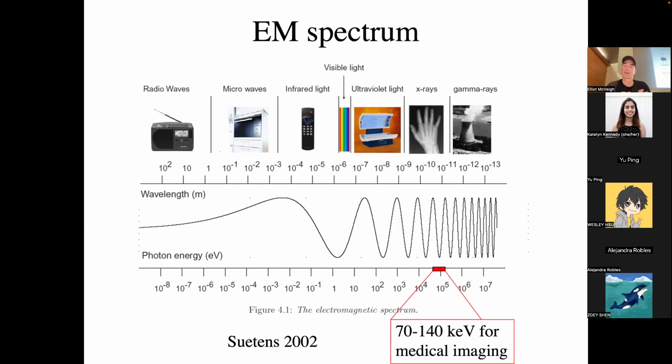I realize we've got a lot of frequencies running around here. The fundamental thing in imaging is the spatial frequency, the cycles per millimeter of the pattern of the thing I'm imaging. The frequency in megahertz here is the frequency of the radio frequency energy coming through. That has nothing to do with the spatial frequency of my picture. But Fourier comes into play everywhere, so you think of spatial frequency and temporal frequency.